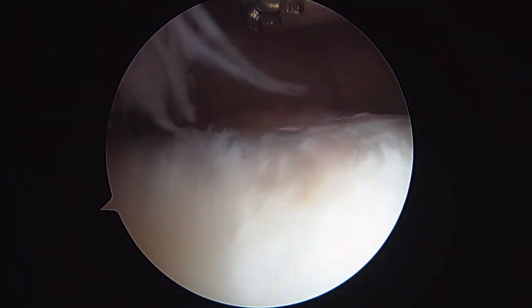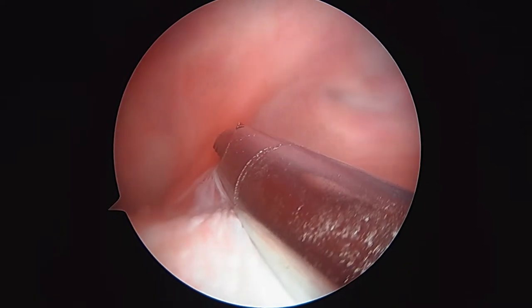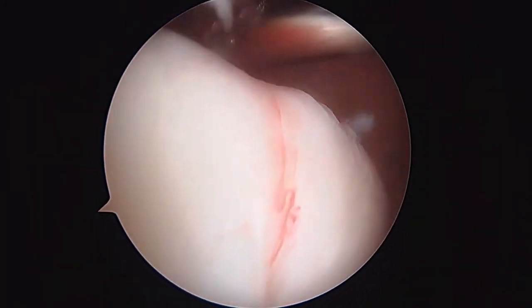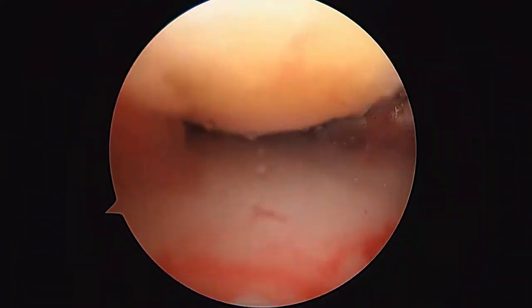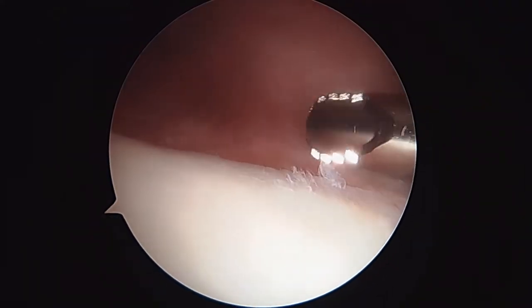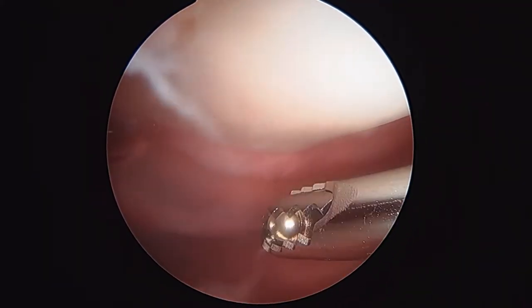So we're up in the suprapatellar pouch, looking superiorly. Lateral is over here to the left, medial is over here to the right. We don't want to shave too much — you don't want to get too much bleeding yet. We'll pull back a little bit. There's the patella. You can see the patella at the top of the screen there, and the cartilage on the undersurface of the patella actually looks pretty good.